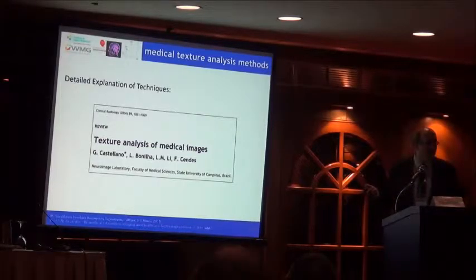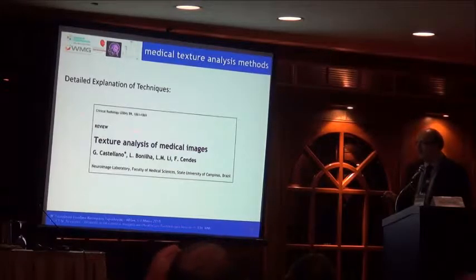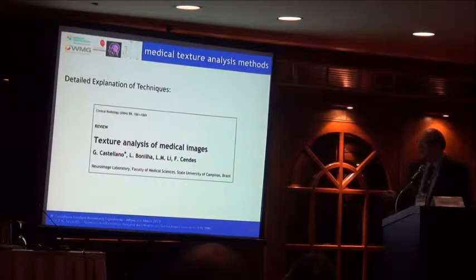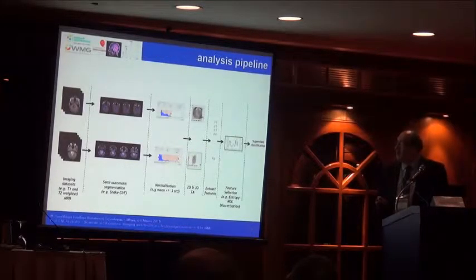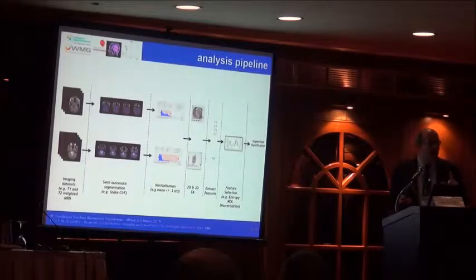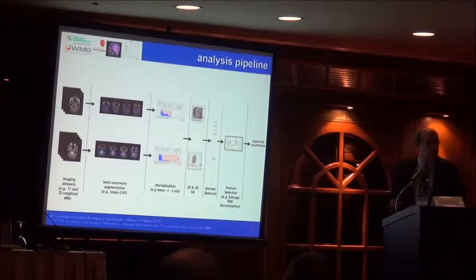So using all this, we try to do some of the work. I haven't covered everything, and this part was a little bit didactic, so I apologize again if you know about it. But again, there's a recent paper in clinical radiology, where Castellano has described how we have used in CT and initial MRI experiments these techniques. And I would recommend it if you want to go into that area. So the challenges are to develop a pipeline that is almost semi-automatic and supports radiologists to make better decisions in diagnosis, prognosis, and management of the disease.